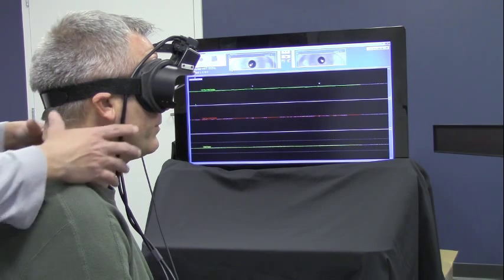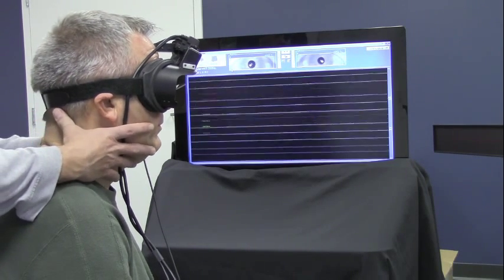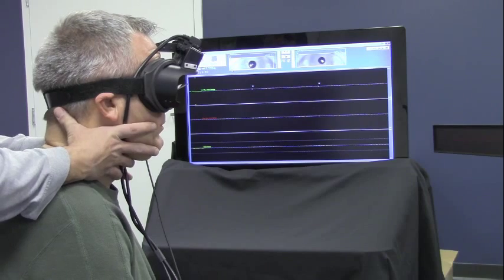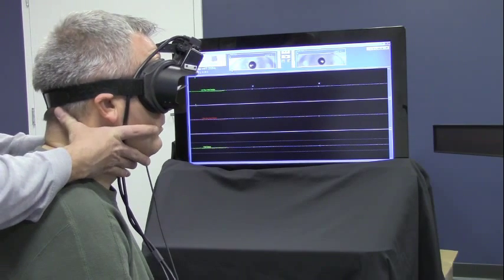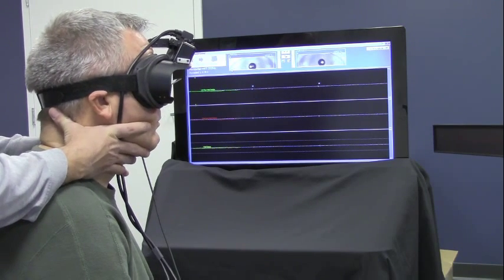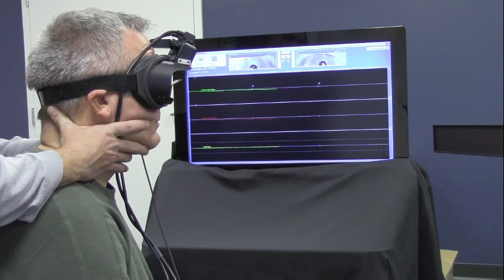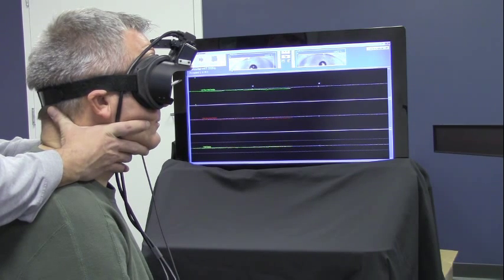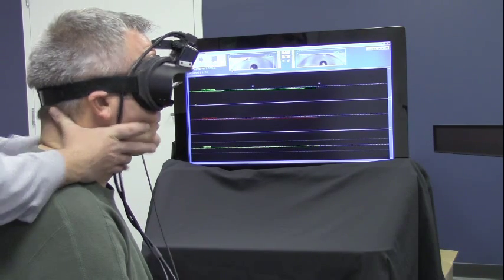Once you start the test, there is no big rush to start moving the patient's head. After you've got a new grip and the patient's clenched their jaw, then you can begin the head thrust test.